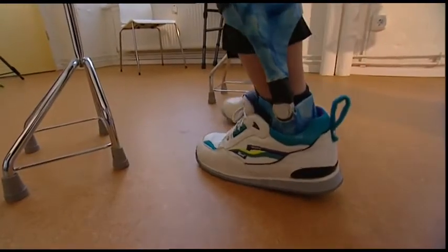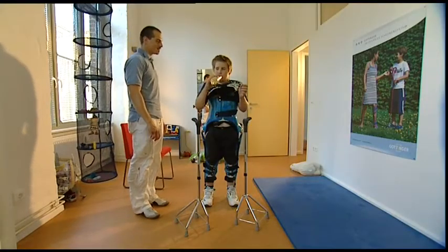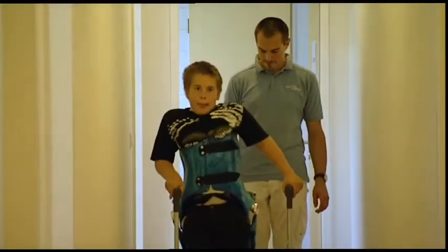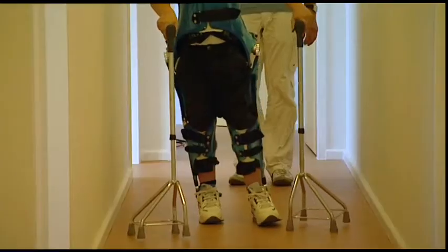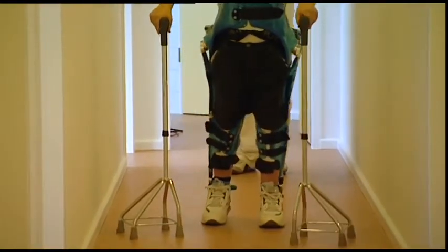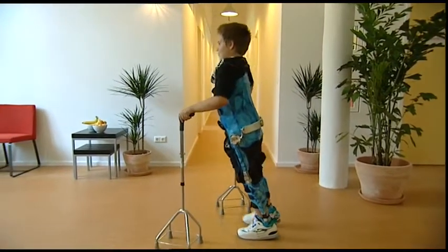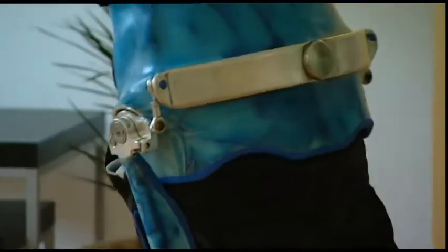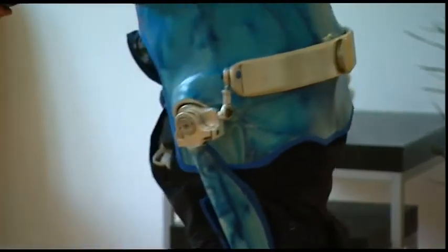The Twister also provides its user with a reliable stable free-standing position, giving the patient a confident sense of space. Randy can now take visible advantage of a guided rotation, since he is able to walk better while saving his energy. Avoiding the rotation of the orthopedic shoe sole on the floor, he can also make faster headway.